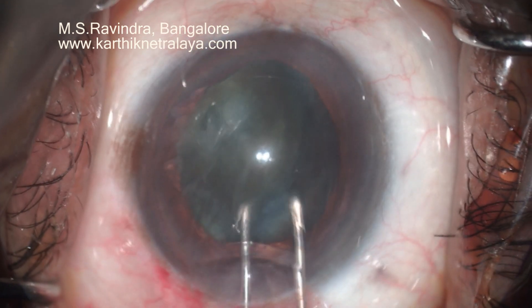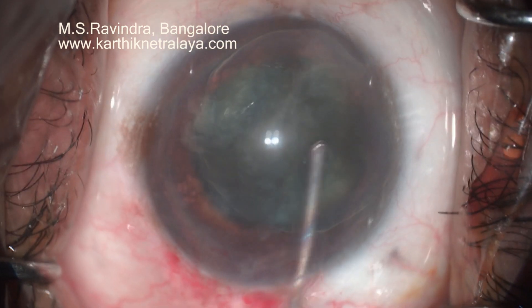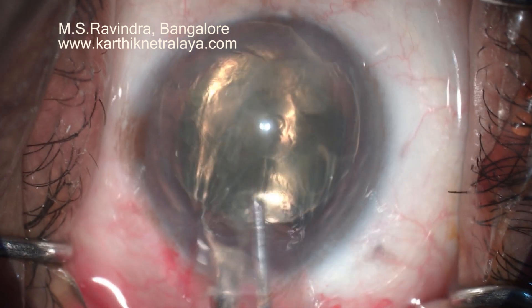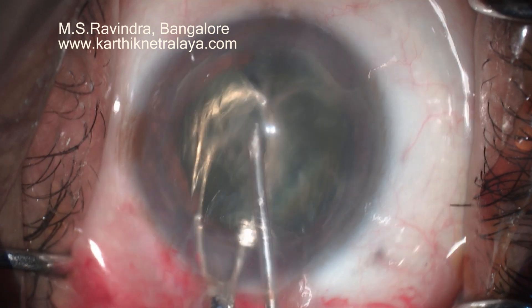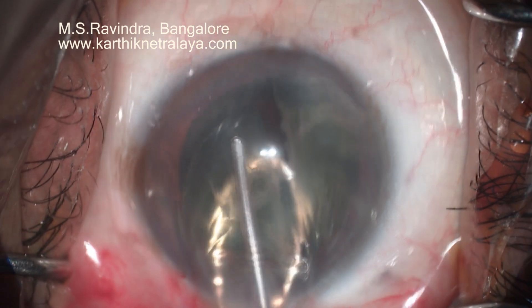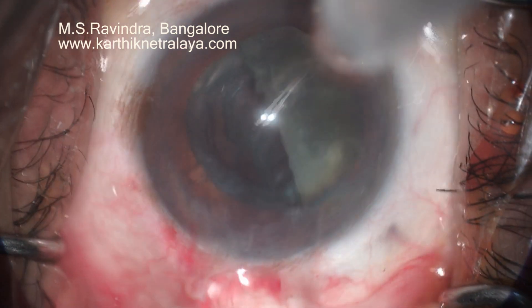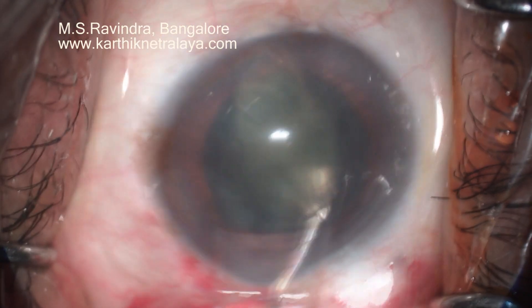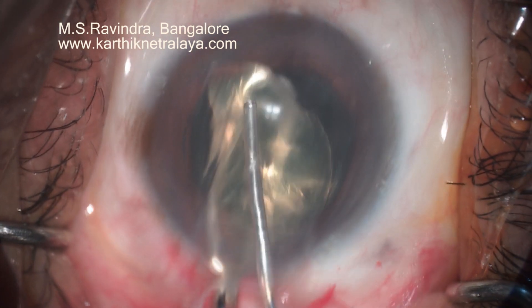Nucleus and epinucleus are not separated from each other; there is only a capsular separating hydrodissection done. The nucleus can be easily rotated and brought into the anterior chamber. The nucleus is bisected using a support of mini wire vectis behind, which is very small in size compared to the standard ones, and the 25 gauge cannula continuously injects viscoelastic.